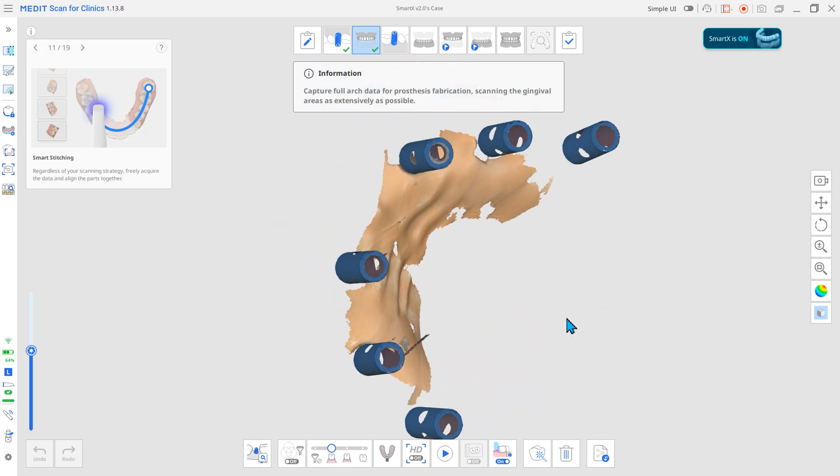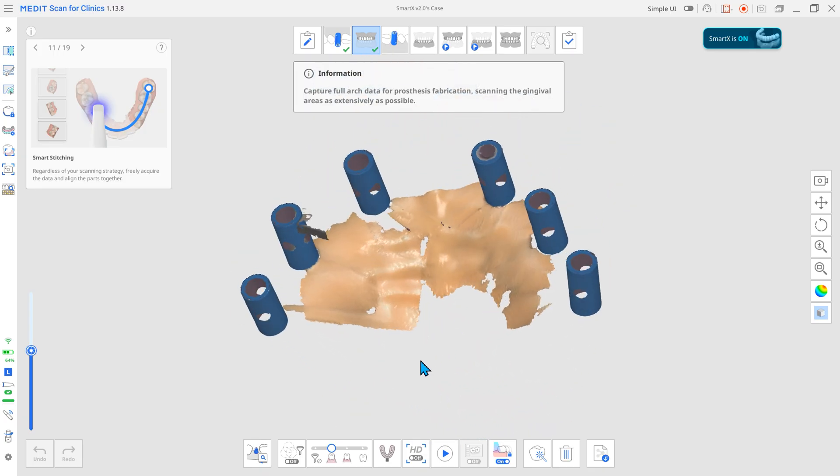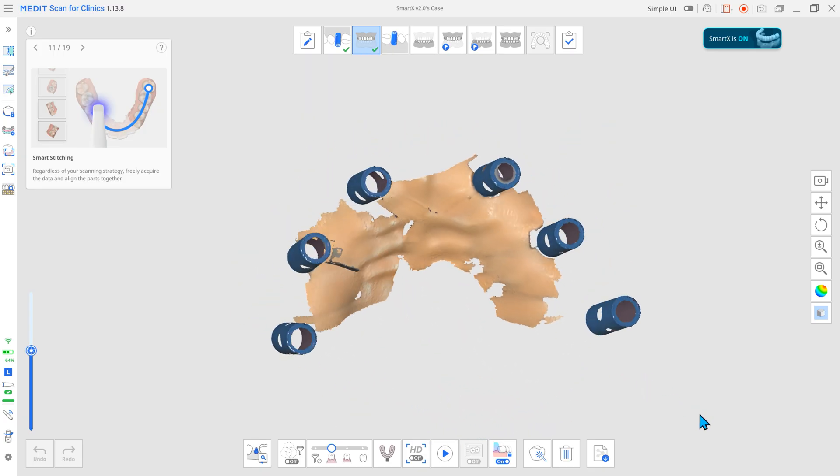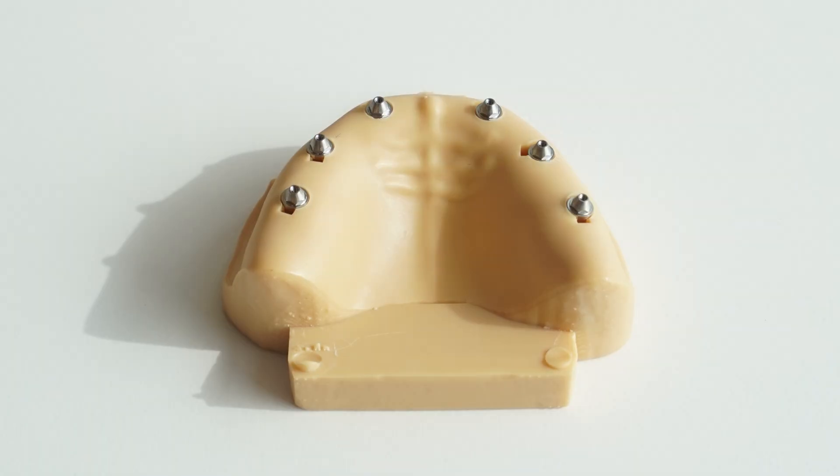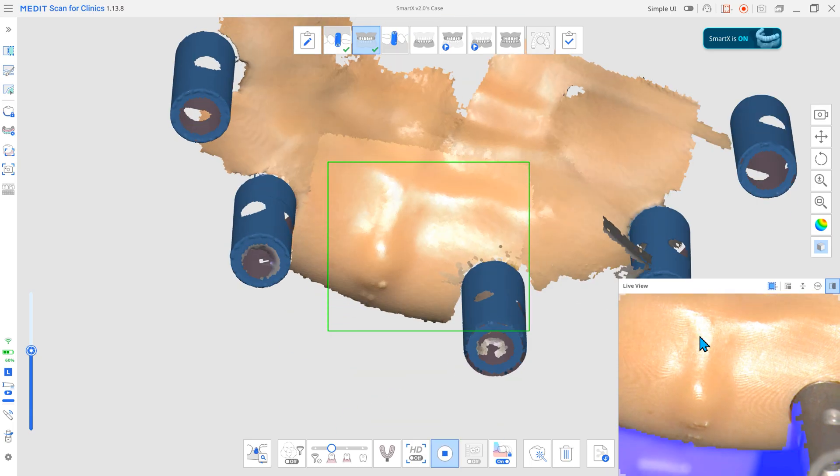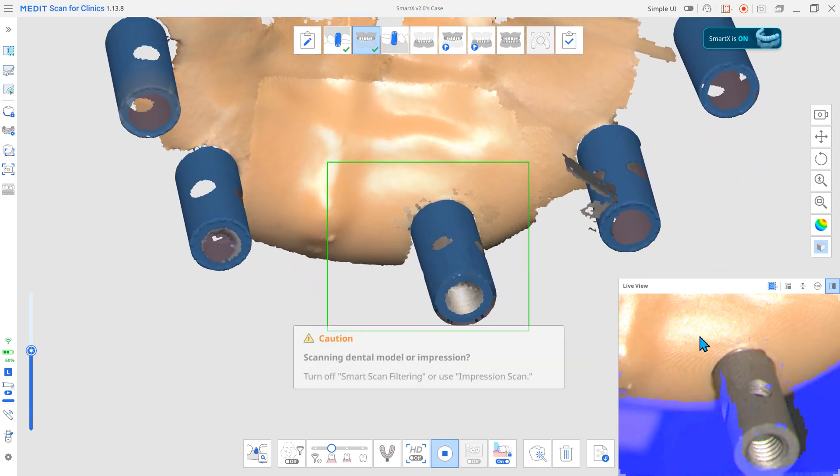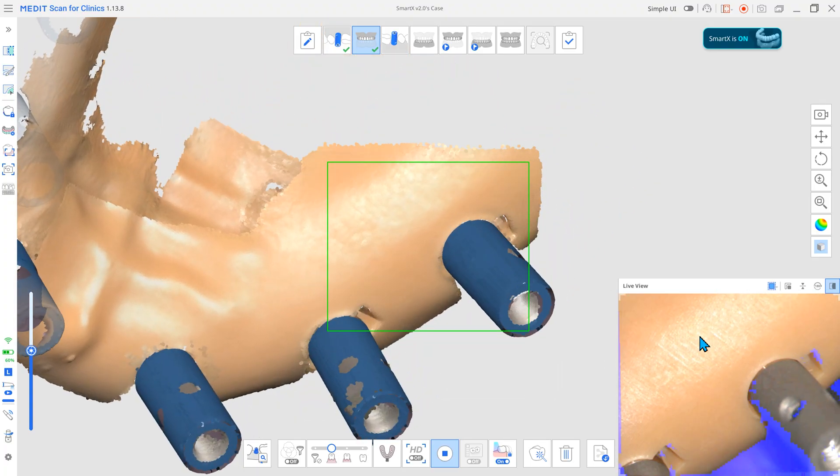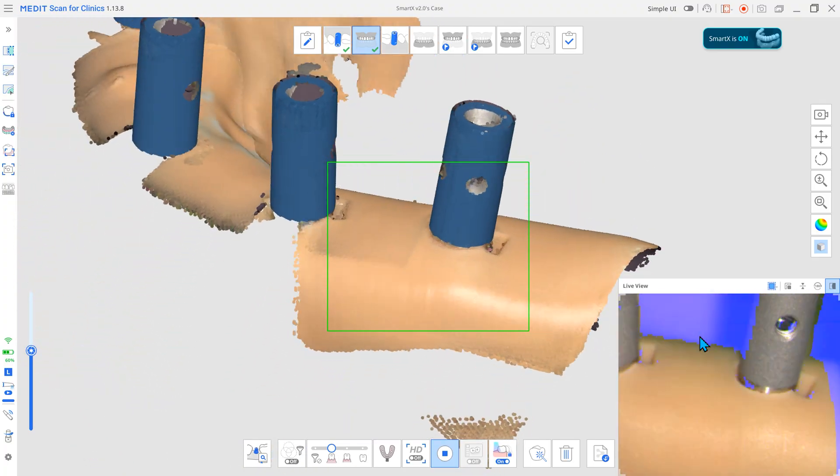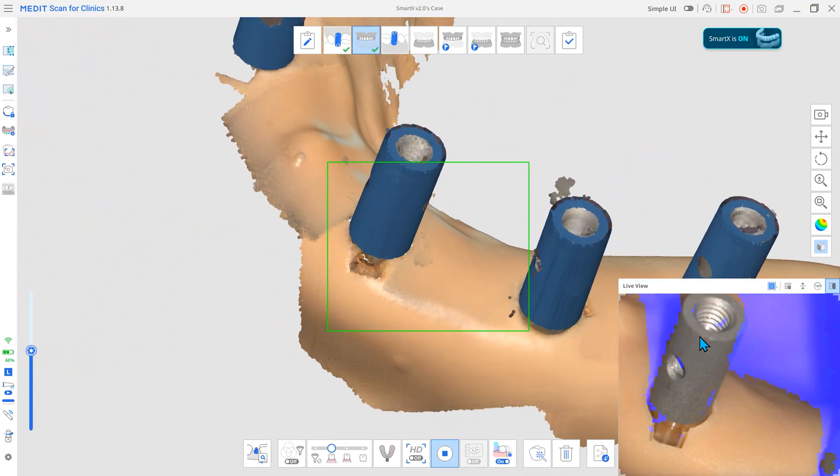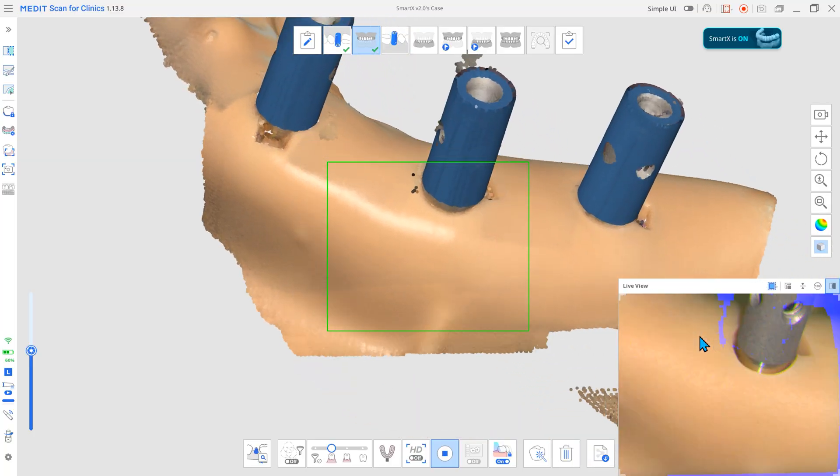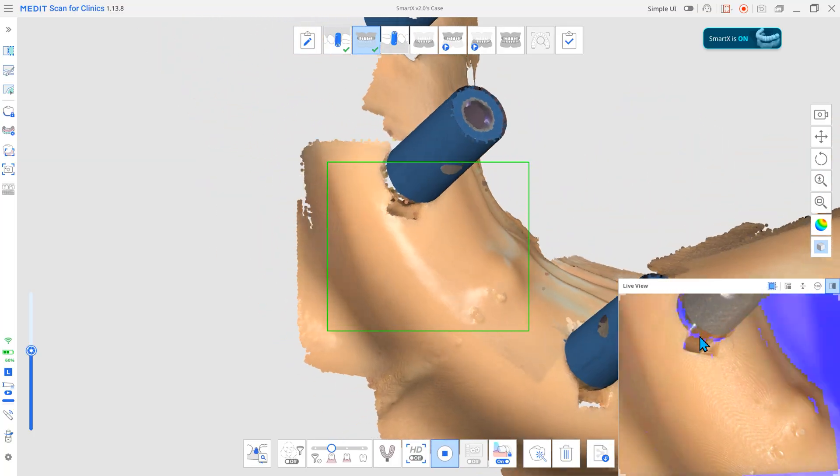In the next stage, only the anchor cap library remains. Remove the scan body and attach the anchor cap. Next, scan the surrounding soft tissue based on the converted anchor cap. For more reliable scanning, start from the gingiva area recorded in the previous stage.